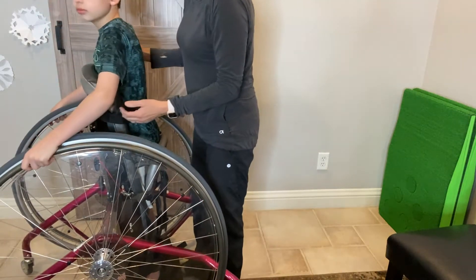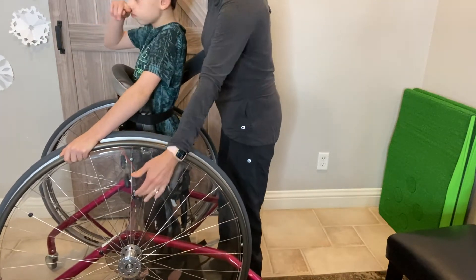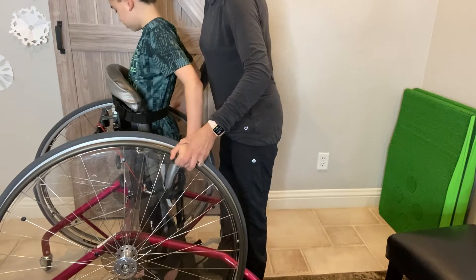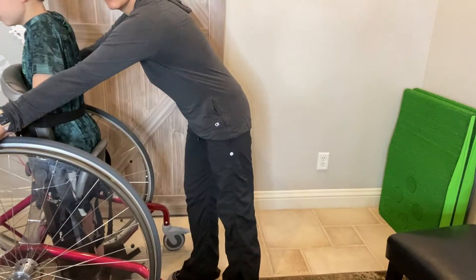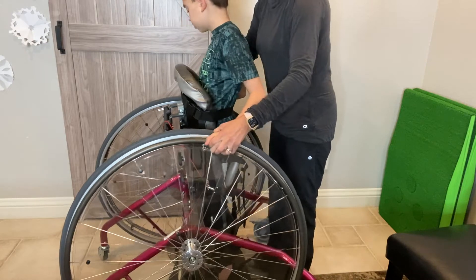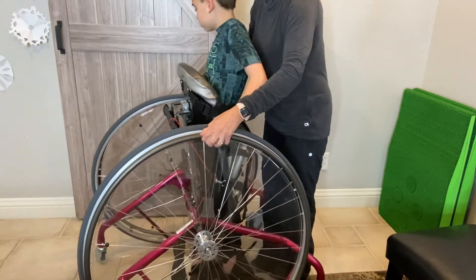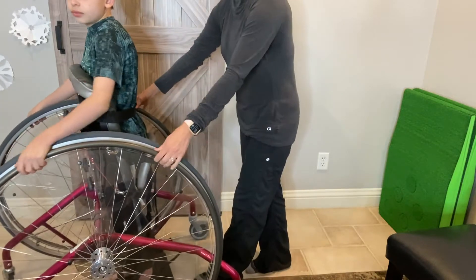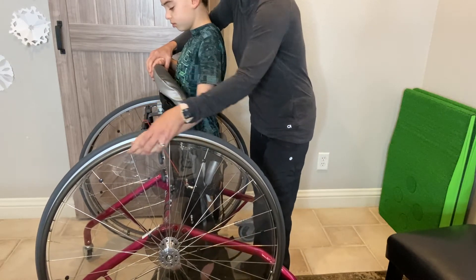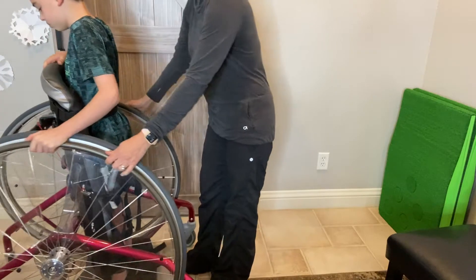If we're in a mobile stander it's already going to be set up for us. If we're in a wheelchair, we want the axis of the wheel to be a little bit in front of the trunk, because that allows the child to reach back further and get a really good push. Most kids when they first learn, or kids with CP that don't have this kind of shoulder mobility, are going to do little pushes — and that's still awesome. We just want them to realize there needs to be a forward motion of the shoulder. If you can only get them to use one hand at a time because they have one hand with more spasticity or less mobility, show them they can push with one hand and then push with the other so they're still going in a straight line.